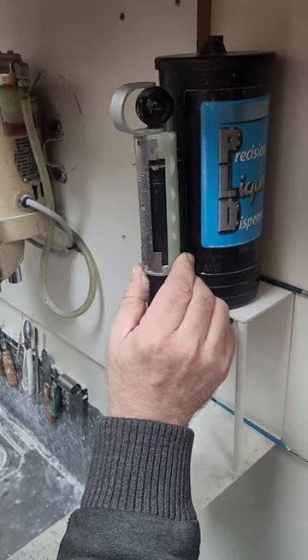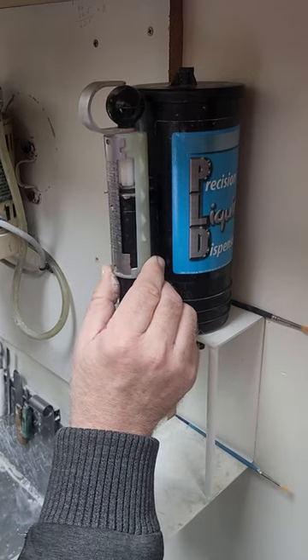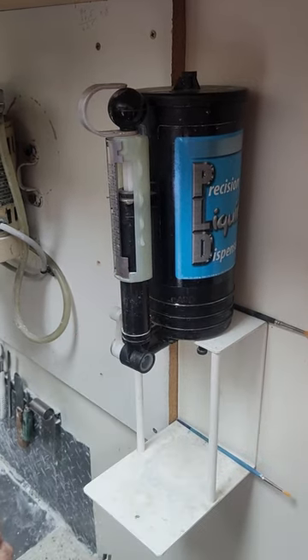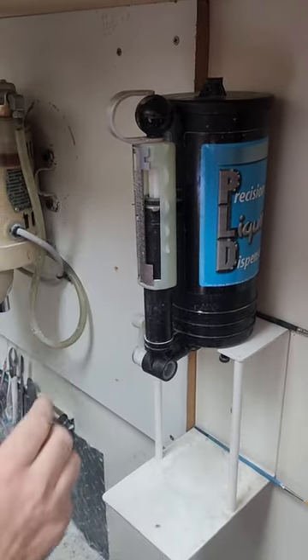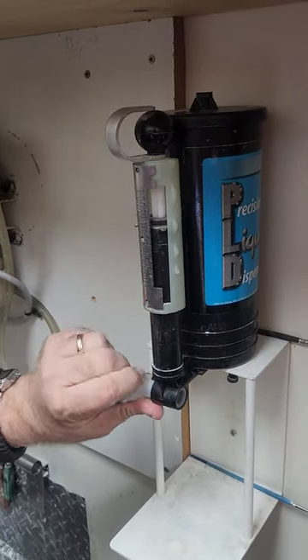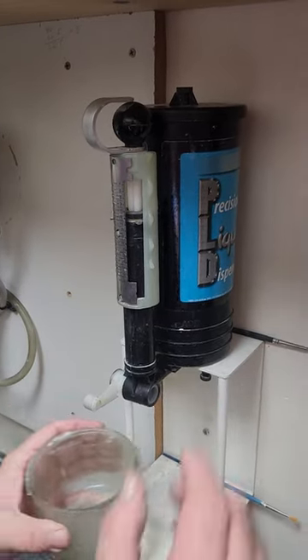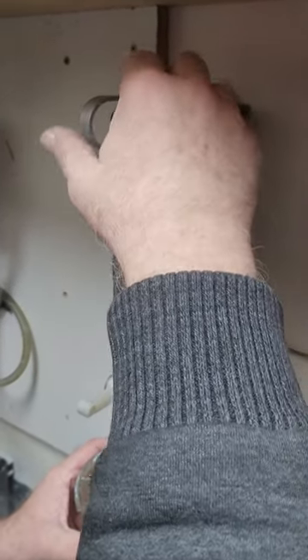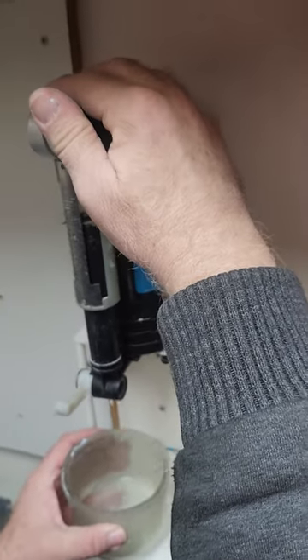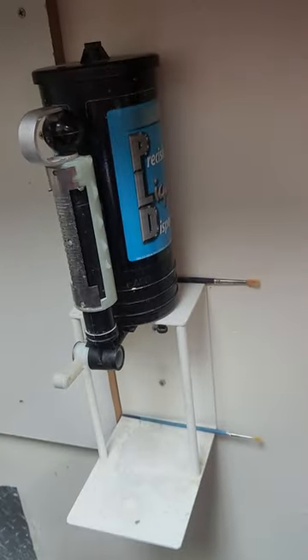We're going to measure out 12 cc's of water. I've got the 12 right here and it's set. We'll take this, open it, and twist it slightly then push the water down. That gives us 12 cc's of water.